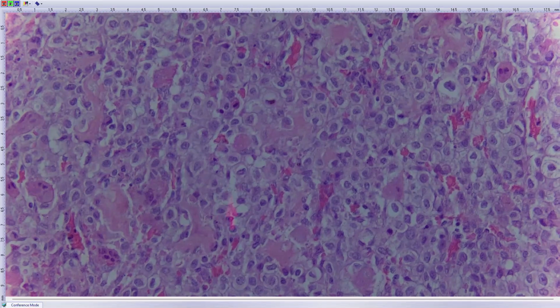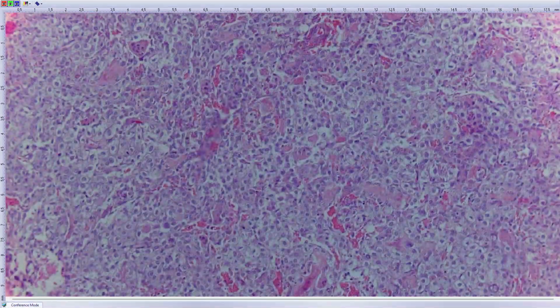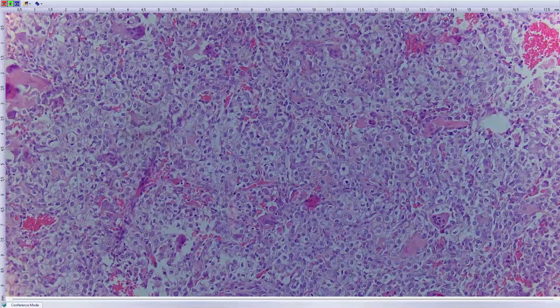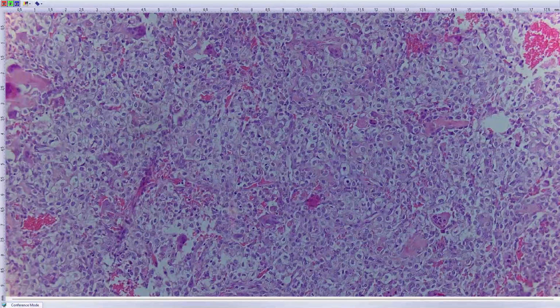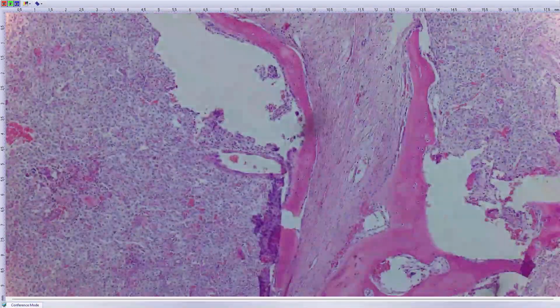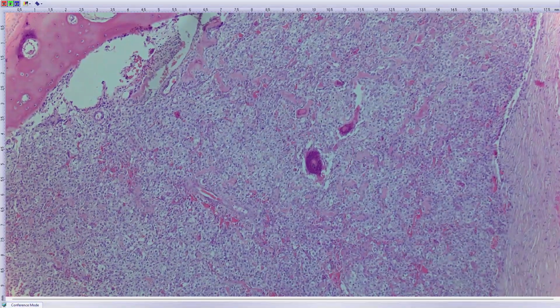So in this case, not all tumors that are called clear cell are composed of clear cells, like clear cell sarcoma, for example. It's not typically composed of clear cells, but here it fits. It's mostly clear cell cytoplasm. Pretty uniform cells in most cases. The tumor, when it's detected in time, is quite indolent. It's a low grade sarcoma. If it's detected early and completely resected, usually it doesn't recur or metastasize. But when it's detected too late, such as in this case, it can of course have distant metastasis. It's a sarcoma. So, clear cell chondrosarcoma.